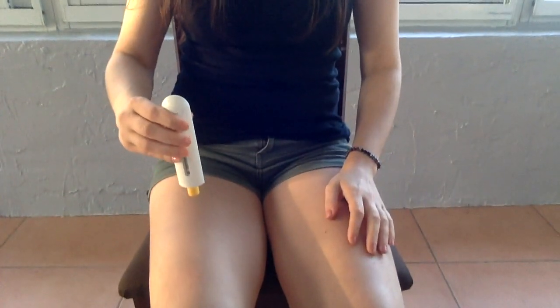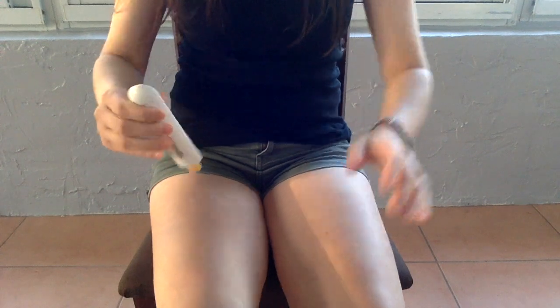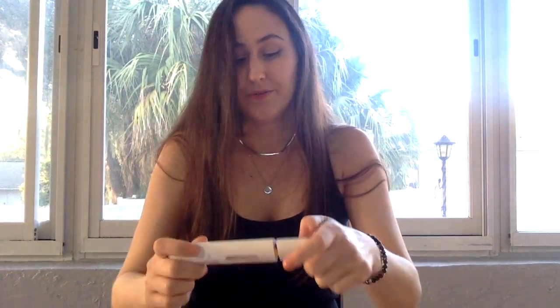So when you're ready to inject, you're going to take this off. And at a 90-degree angle, you're going to go in like this and press down, just straight down. If you're doing it in that area around your belly button, same thing. So you're going to hold it there, you're going to push down, and you're going to hear a click.